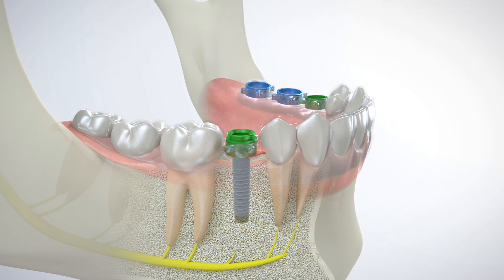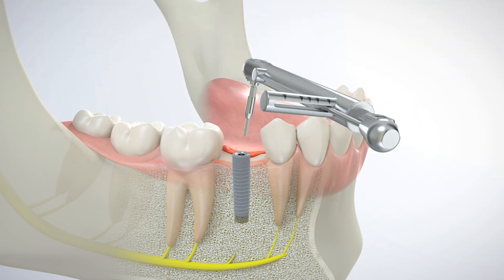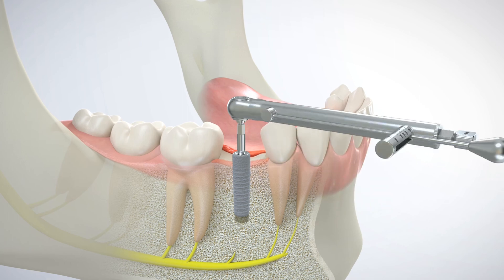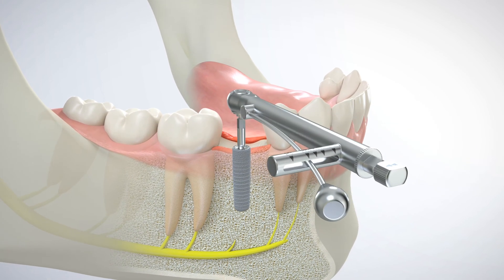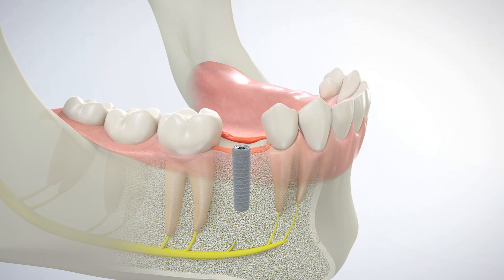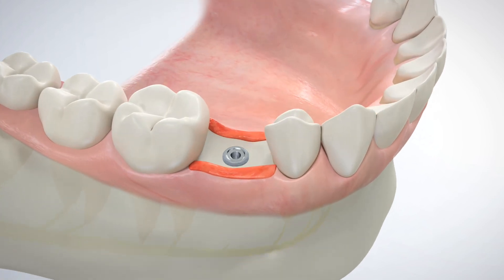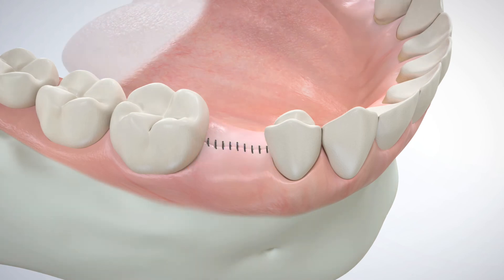The GRS surgical guide and GRS surgical drill sleeve are removed. The implant's final position is completed to the pre-planned depth and torqued to the manufacturer's recommended specification. A healing cap is placed over the implant. The full thickness periodontal flap is closed and sutured.